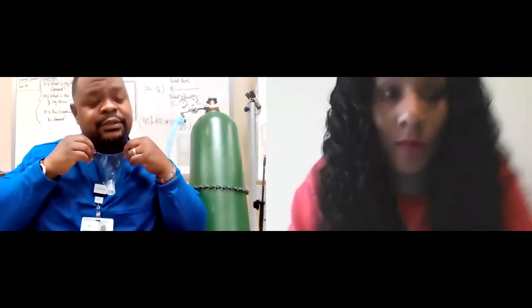I can put a little face tent there. It'll blow that FiO2 right there in your face, no matter how you're breathing, because this is a high flow system, right? Don't forget, you either have two issues, ventilation or what? Oxygenation. Those are two different problems. So what do I do if they needed ventilation? Probably going to have to trach them. If their face is all crushed up, they will have to have an emergency tracheostomy.